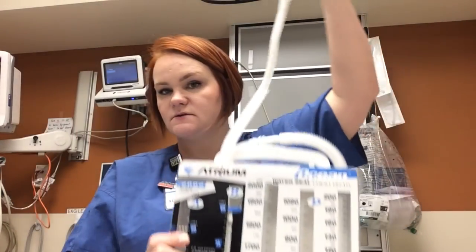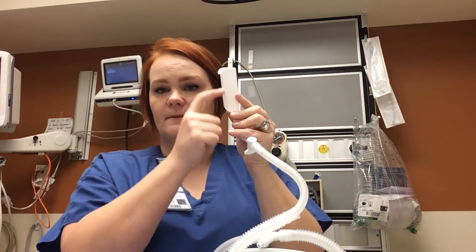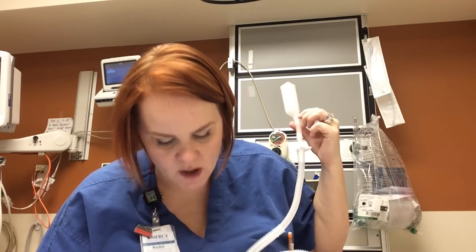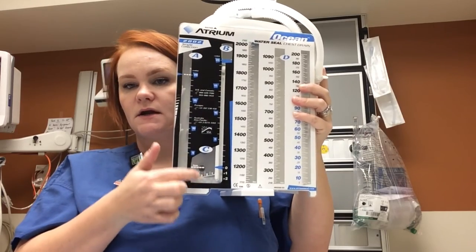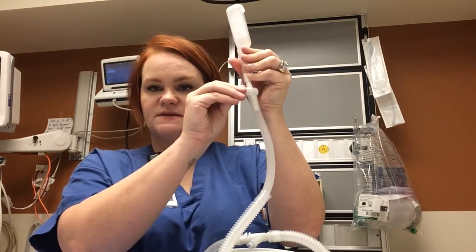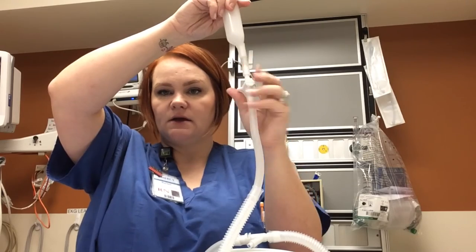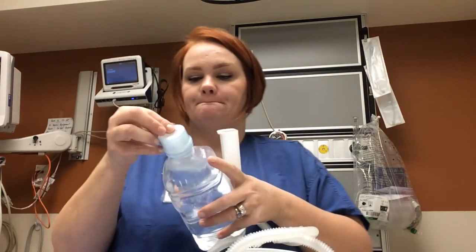So the first thing to do is go ahead and pull this piece up. And this is a measurement of exactly how much water you should put into your water seal. So you go ahead and turn this into the off position, pour your fluid in up nice and full, and then you're going to go ahead and turn this. So we'll demonstrate that right now.